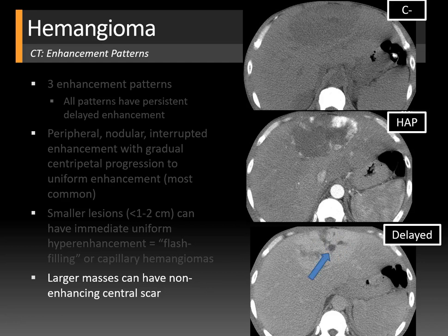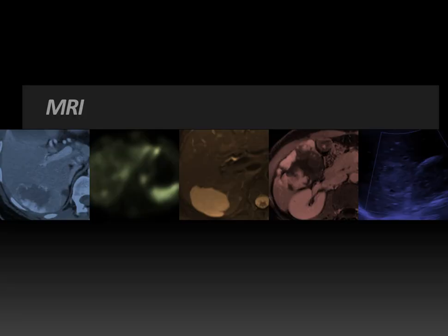One additional note: sometimes the scars in large hemangiomas may calcify. This is not specific for hemangioma and can be seen with other tumors, but it may occasionally be present.